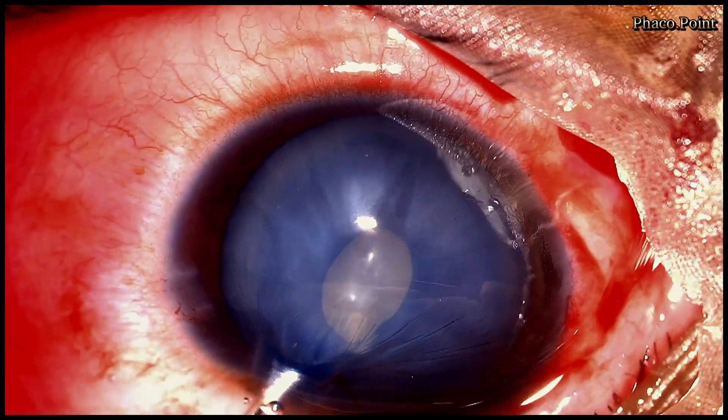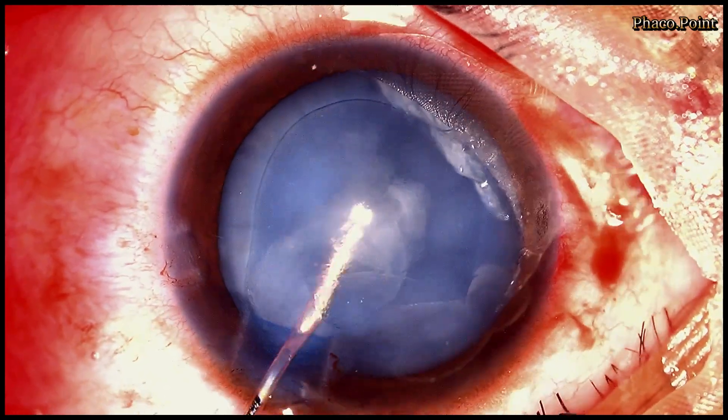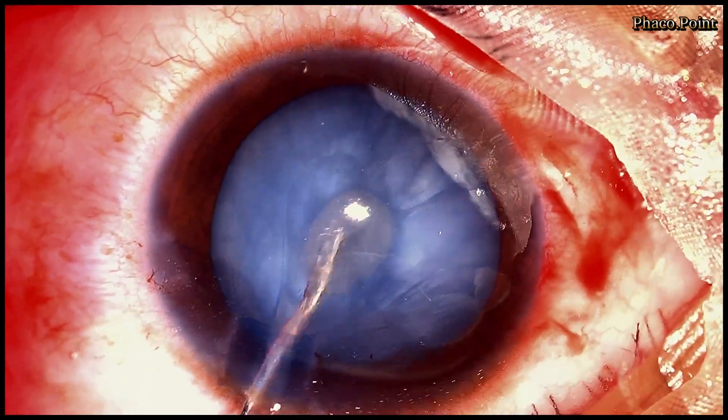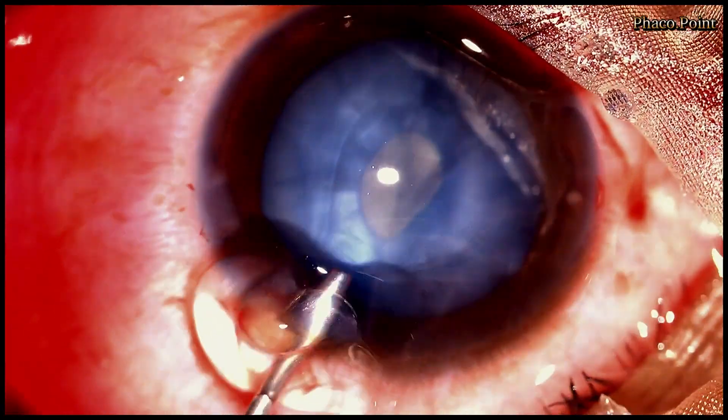Having done that, the excessive viscoelastic is removed after which the cortical material is washed out to decompress the capsular bag. Being such a soft cataract, most of the cataract has come out itself.